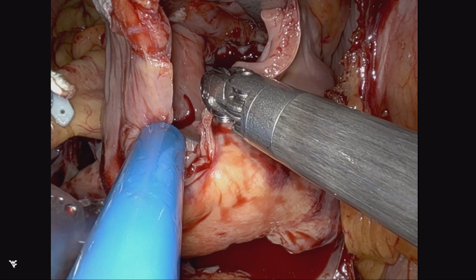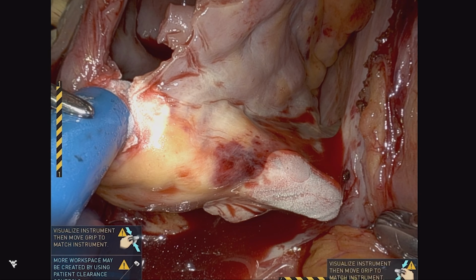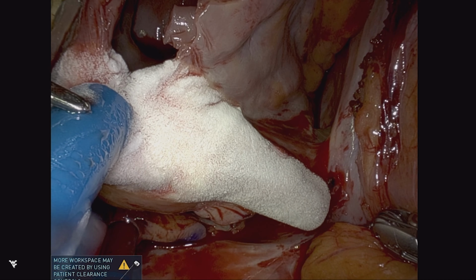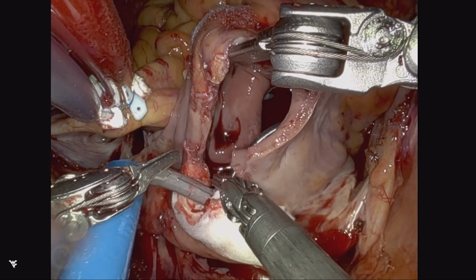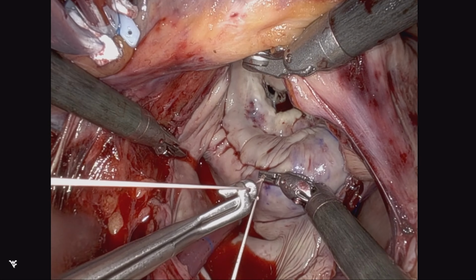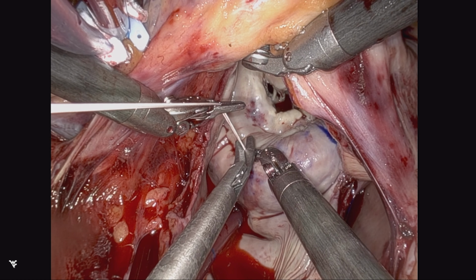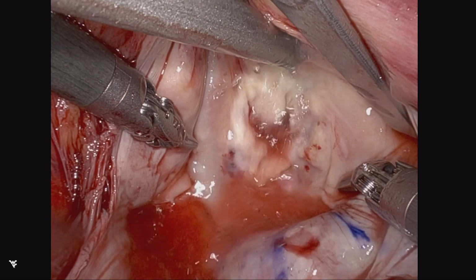This does demonstrate the care it takes to make sure we don't make your incision near the atrial lead or your ablation that actually jails the lead. It makes it non-functional. And completion with closing of the left atrial appendage. So now let's approach the mitral valve.